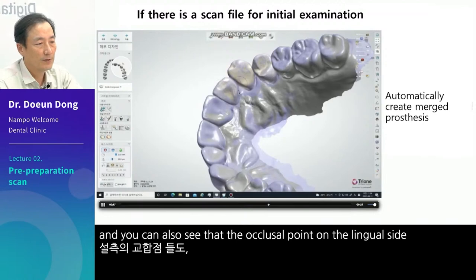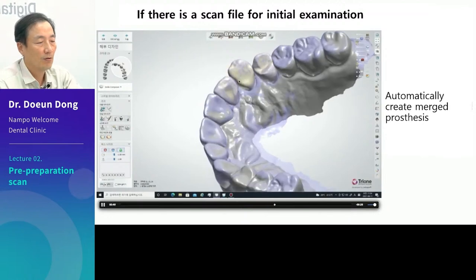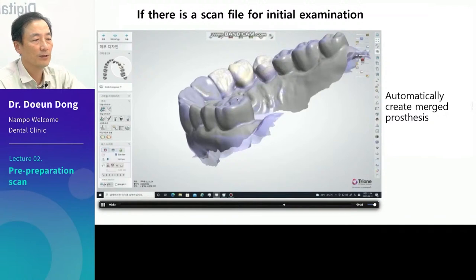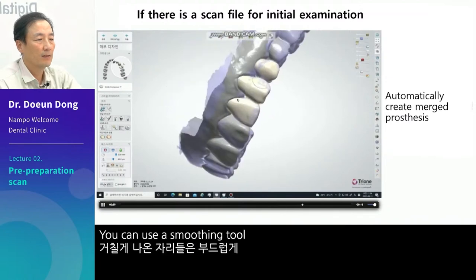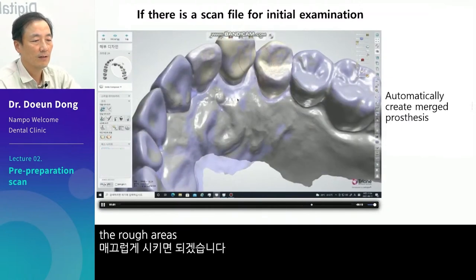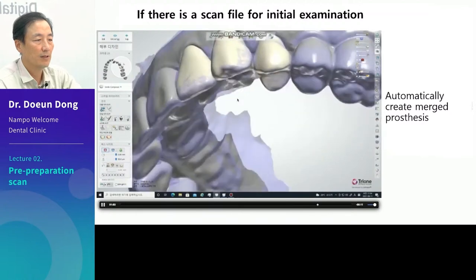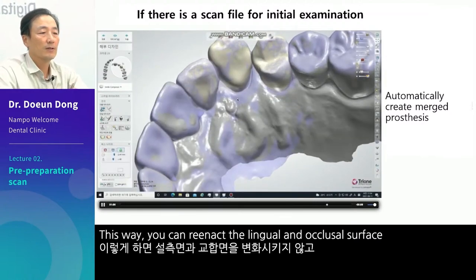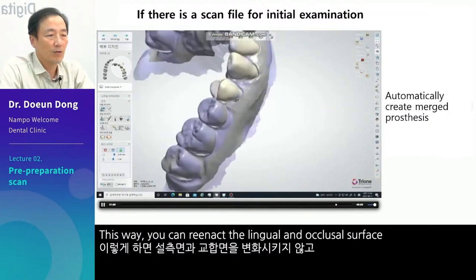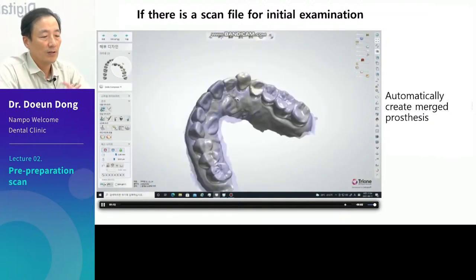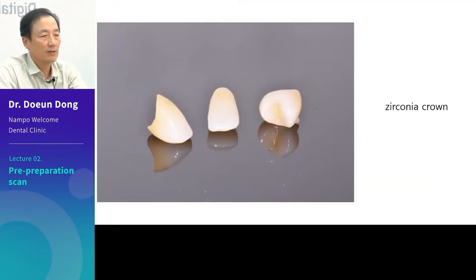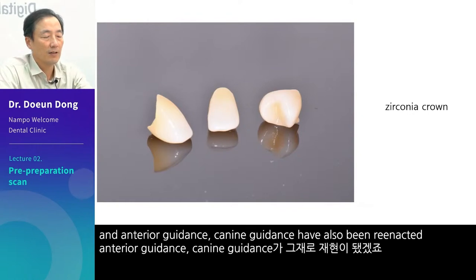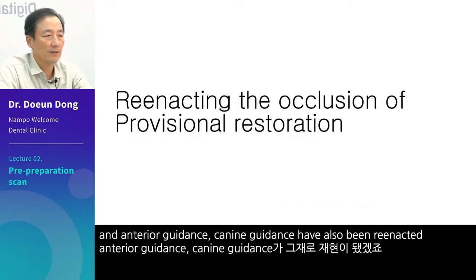And you can also see that the occlusal point on the lingual side has occluded well. You can use a smoothing tool to smooth out the rough areas. This way, you can reenact the lingual and occlusal surface without changing them. Then you can put it in the milling machine. This is how the zirconia crown is made. The lingual surface has been reenacted, and anterior guidance and canine guidance have also been reenacted.